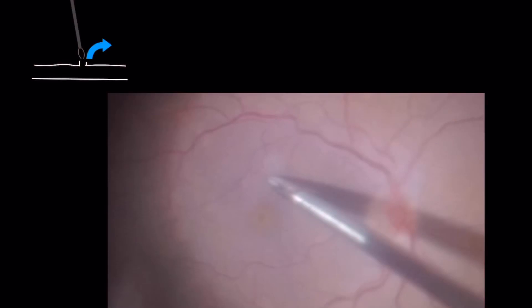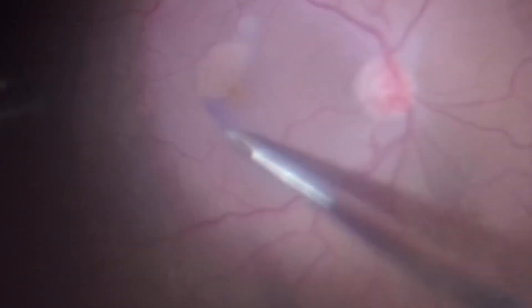You can use the retinal forceps to re-grab the ILM at one of these edges and then pull it circumferentially to complete the peeling.